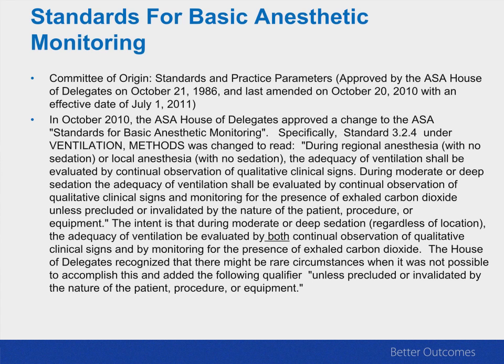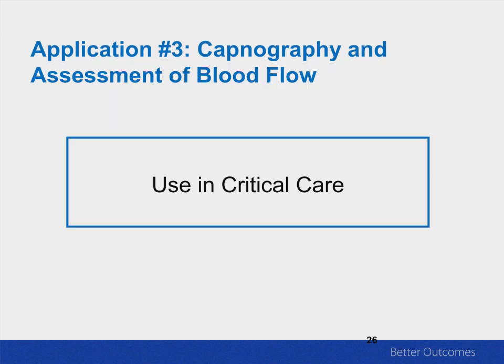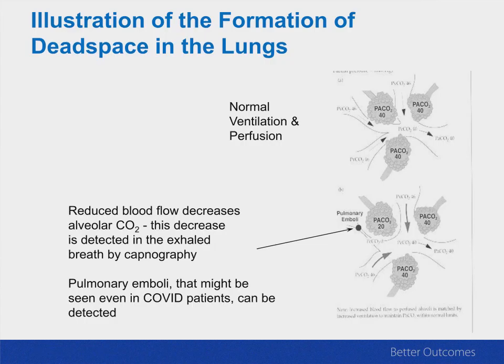Now, this isn't a recommendation from me as a person to you to use capnography. Certainly, the standard anesthesia society recommendation is that capnography needs to be applied if you're giving sedation, or really if you need to monitor ventilation at all. Now, we're also going to go over the idea of using capnography in monitoring blood flow. So I'm going to show you how to use this in acute and critical care.